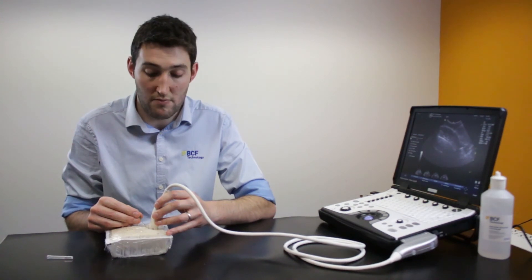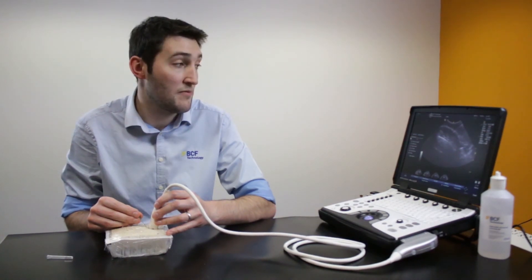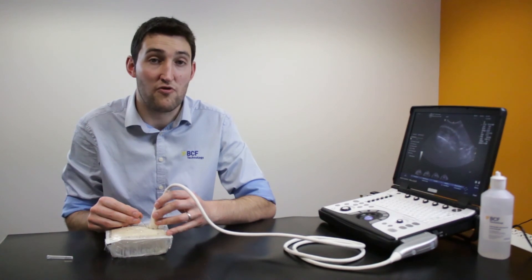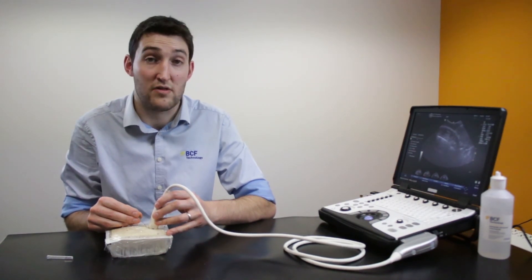What I don't want to do is move the needle towards the probe. Just remember, if you lose the needle, always move the probe to try and pick up the needle, not the needle to try and pick up the probe, otherwise you risk damaging the tissue.